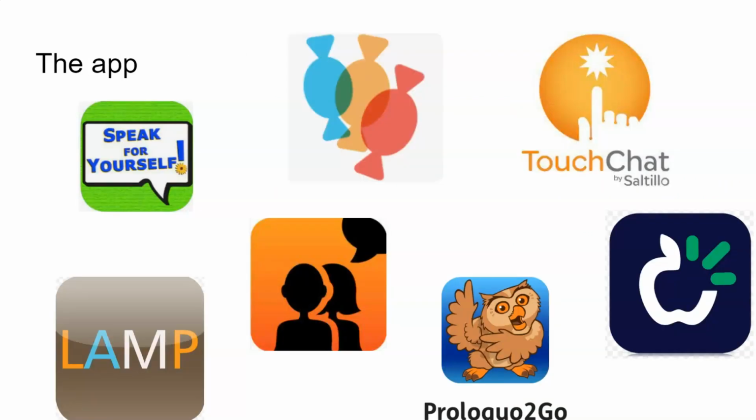The majority of communication devices currently run as apps. It is important to know that if your iPad is provided by the school, they will take care of updating the apps. Sometimes updates to the Apple device can do strange things to the communication apps. If this happens, please let the team know and we will work through it together. Sometimes, unfortunately, it's out of our hands and we will have to use a low-tech solution while the app developers work on it.